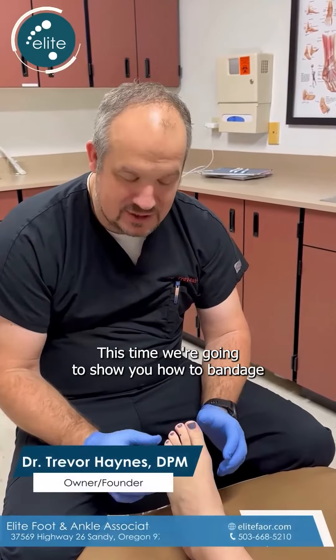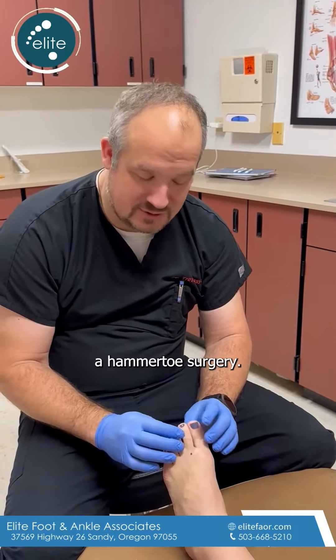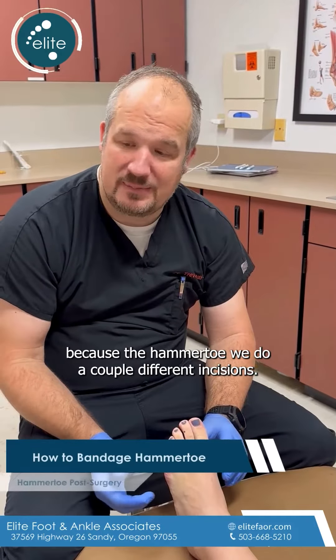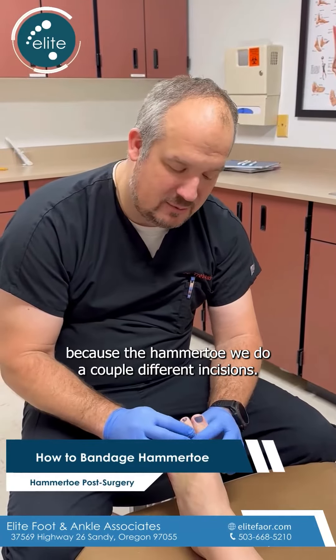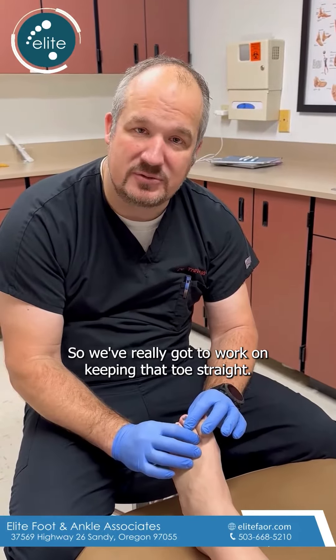It's Dr. Trevor Haynes again. This time we're going to show you how to bandage or re-bandage your hammer toe after having hammer toe surgery. This is a little bit more tricky because with a hammer toe we do a couple of different incisions, and we've really got to work on keeping that toe straight.